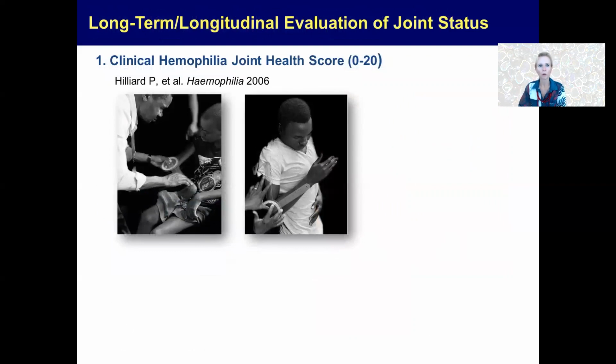So now we come to long-term or longitudinal evaluation of joint status.